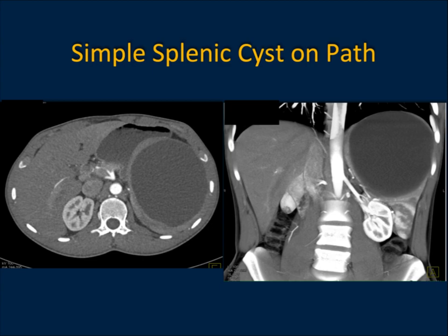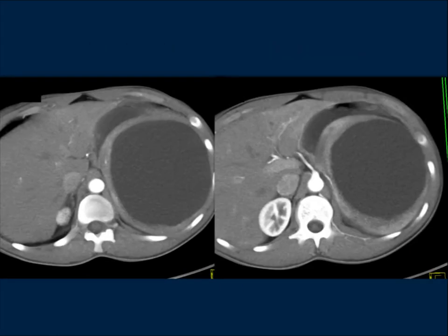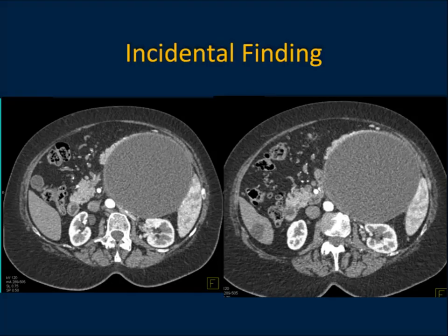Another example — here's a simple cyst, intrasplenic. Size-wise and symptom-wise, this is going to come out. This was a simple cyst: water density, well-defined, with compression of the normal splenic tissue and simply pushing down.